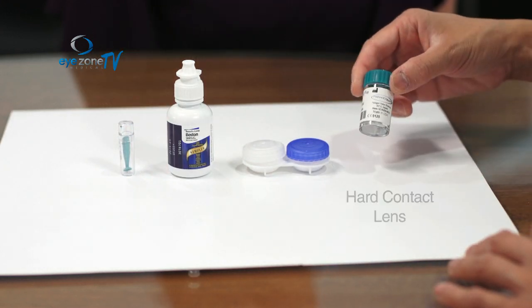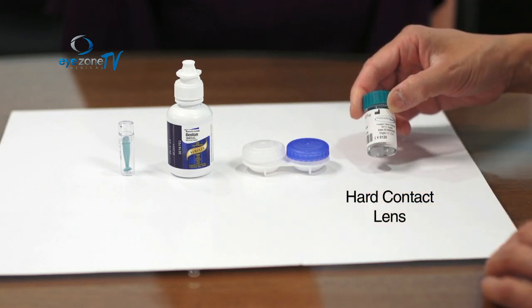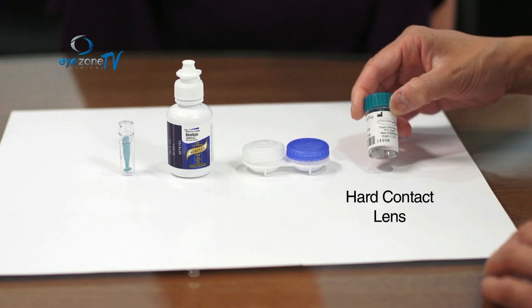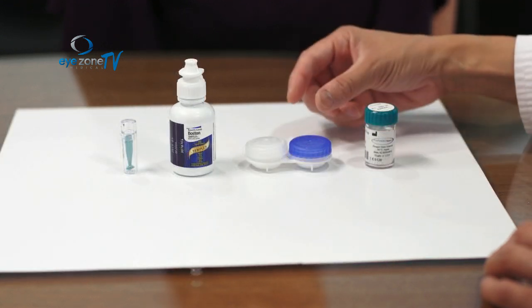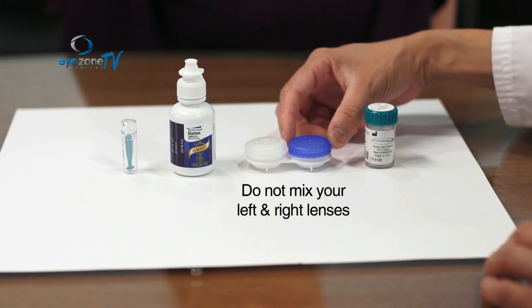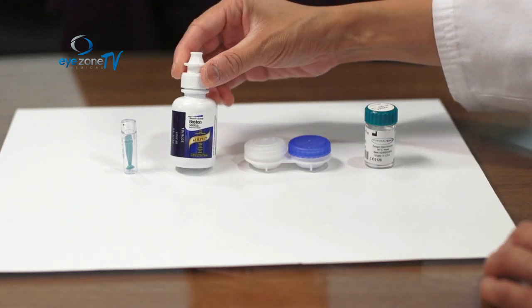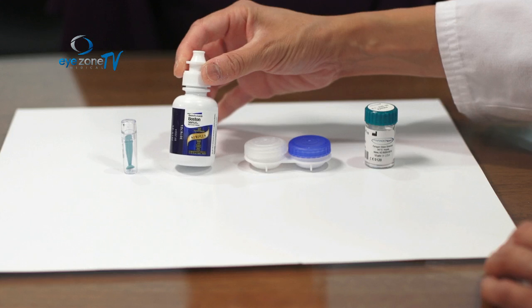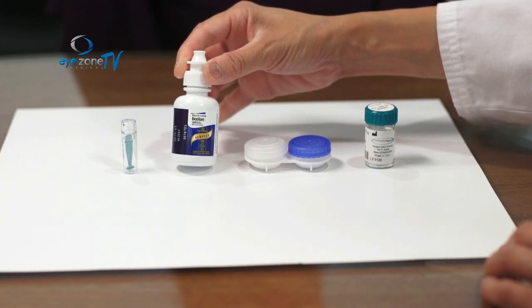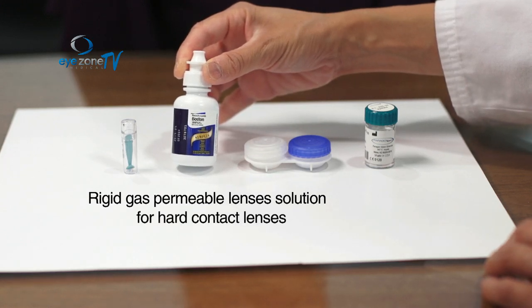The contact lens is actually a hard contact lens — it does not fold over, so you have to be careful not to break it. The contact lens case lets you store your left and right lenses separately so you don't get them mixed up, and this case also needs to be changed every three months. The solution you'll use to clean and store your lenses should be for rigid gas permeable lenses, because your CRT lens is a hard lens, not a soft one.